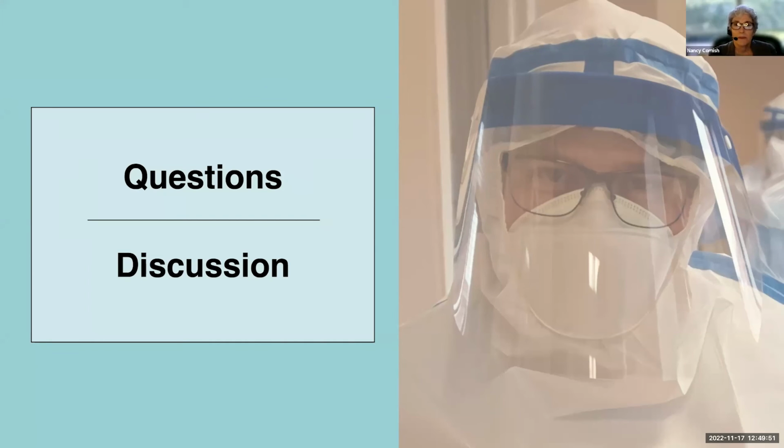Yeah, so with thin smears, the Ebola can be inactivated by the extended methanol. Thick smears, that is not the case. So what we are recommending is you could put a cover slip over it with a quickly drying mounting media.